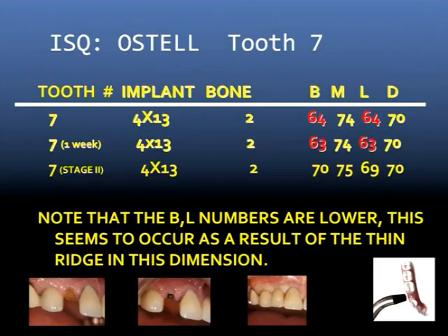When we look at some of the other cases that we've done, anterior maxilla, and we look at the trending, I think there's something that many of you, if you start using the instrument, will notice, and that is that we can determine what the weakest link, I think, in the implant is. And that is, if you look at this slide, buccolingually is a lot weaker than mesial distally. And traditionally in the anterior maxilla, what I see is this come up over and over and over again, where we know that the weakest link in the implant is an anterior-posterior movement or a protrusive movement.